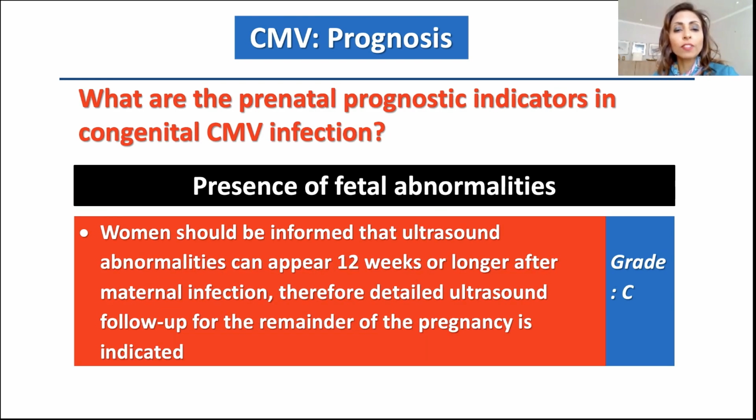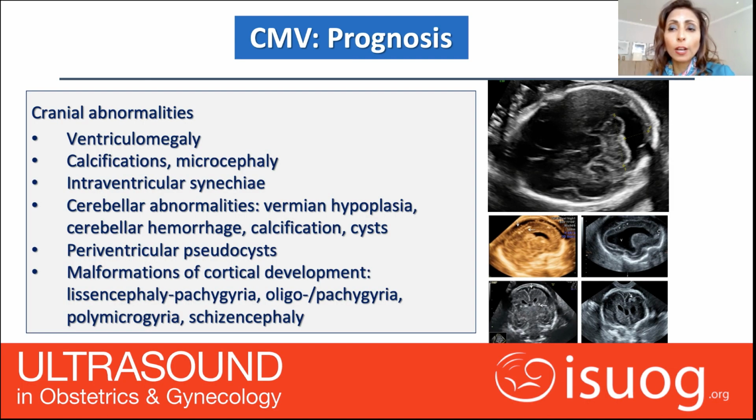The other important fact is that we need to realize that the ultrasound abnormalities can appear up to 12 weeks or even longer after the maternal infection, and therefore we need to follow up this pregnancy with detailed ultrasound scan and potentially repeating the MRI.